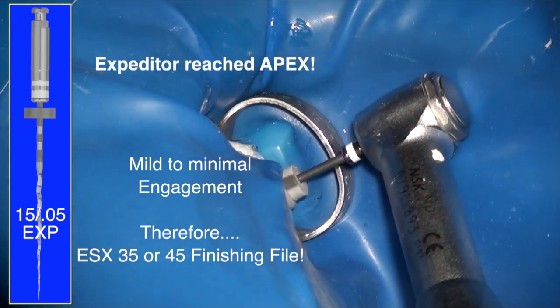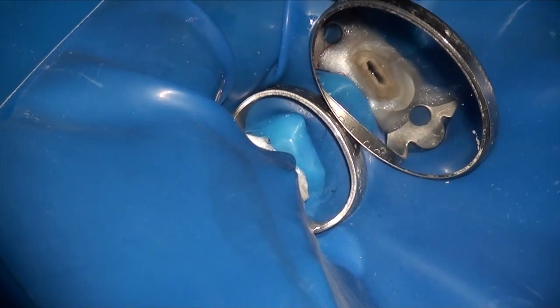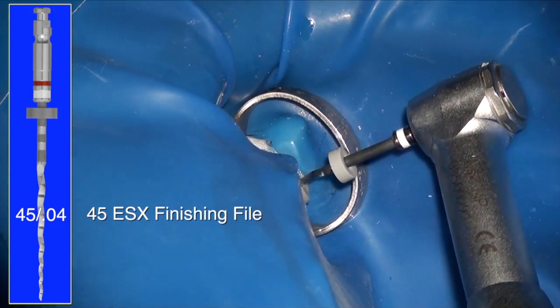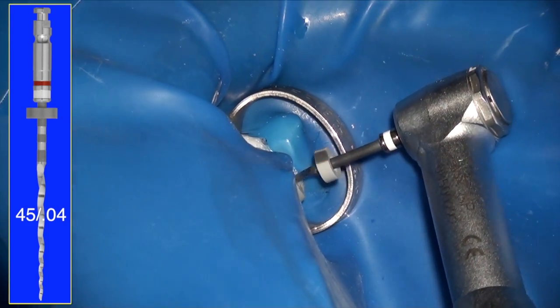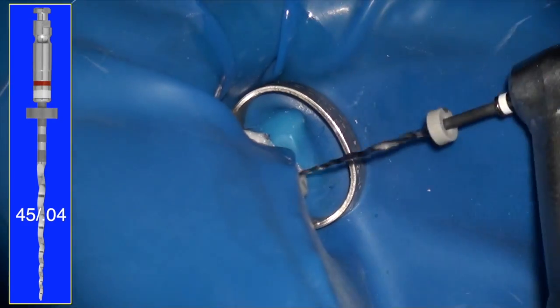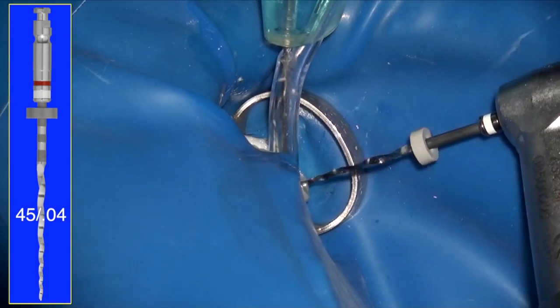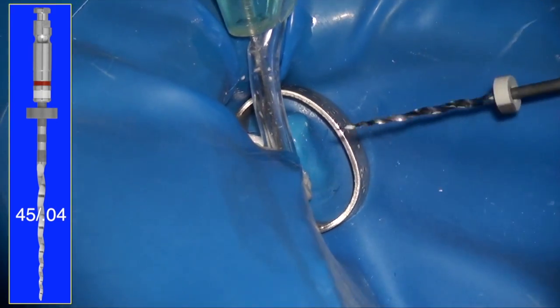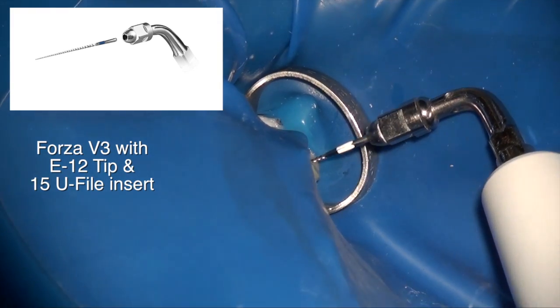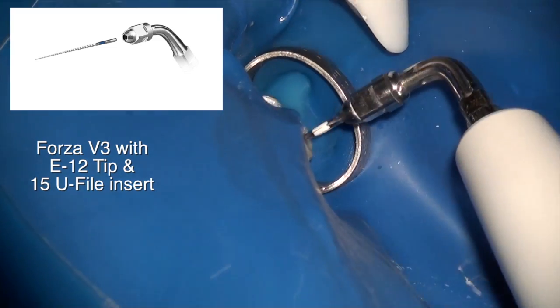So now that we have the expediter down to the apex, based on the level of engagement, we determined that because it was minimal, we're going to use a size 45 tip to finish the apex. Being that this is a necrotic case, using a larger apical preparation is probably warranted, and it would be safe. So you can see here that I'm using the Endo Swipe, the brush that cleans the file after every stroke. And it's important that after about 4 or 5 strokes, you use your ultrasonic and water to clean the debris that you've cut off. The SSC motion, the single stroking clean motion, really does a great job to act like a spoon and remove the debris that you've cut from the canal, which you then use the Endo Swipe brush to clean off.